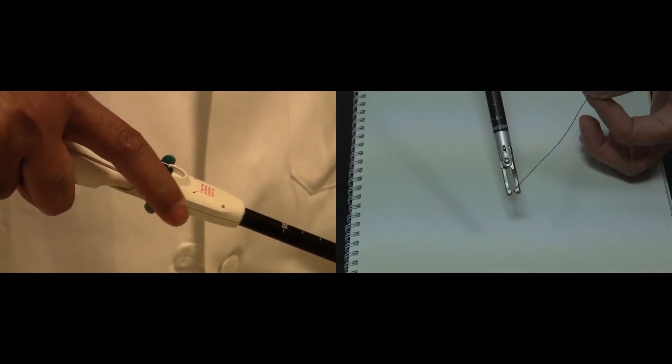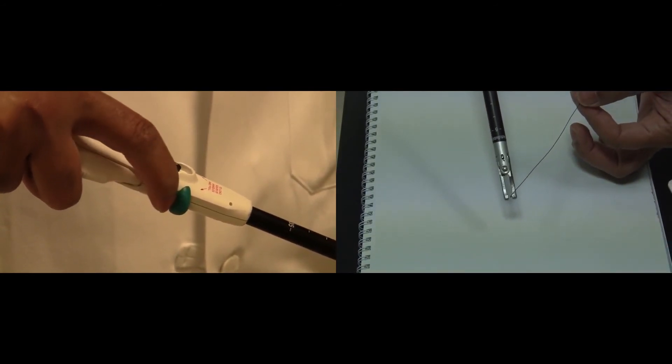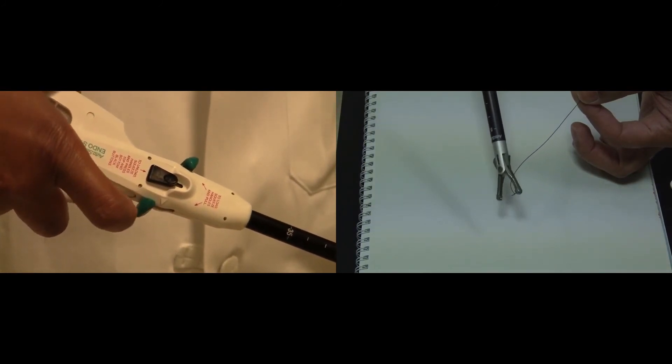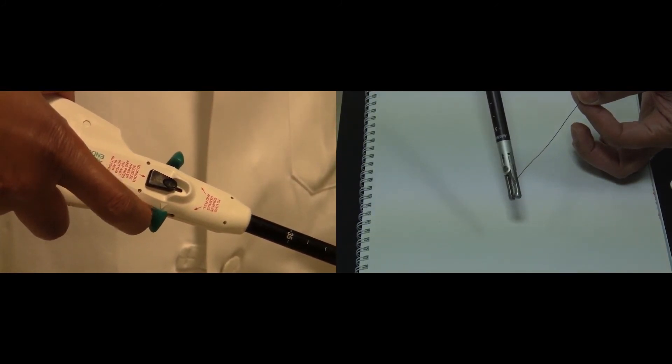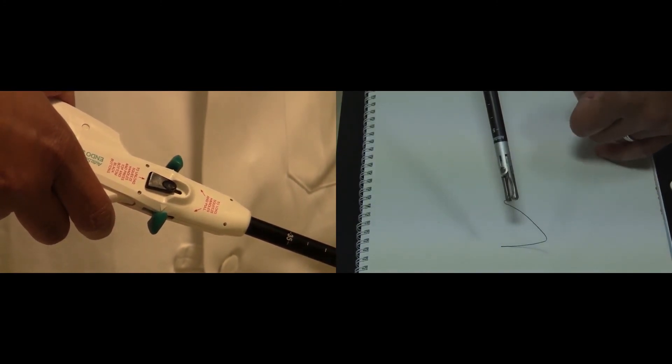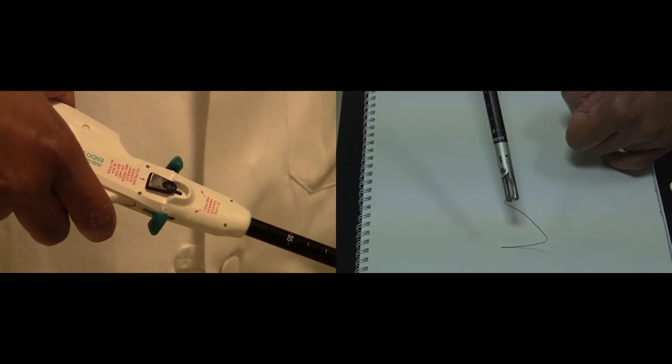You want to test the needle by toggling back and forth to make sure that it's transferring from one side to the other smoothly. Remember, at any time the levers are in the midpoint position, that's going to lock your device at the tip and not permit movement. That is how you load and unload a needle on the endostitch suturing device.